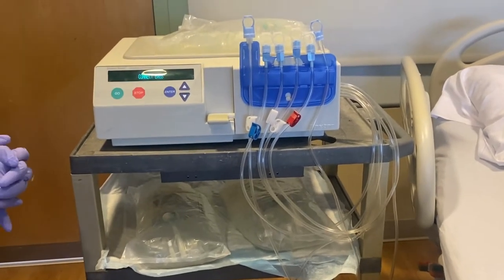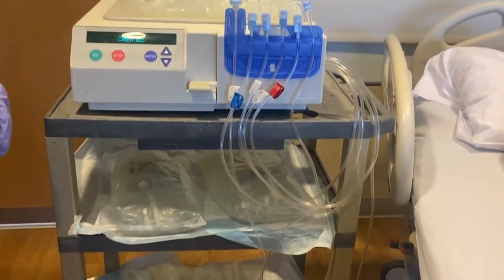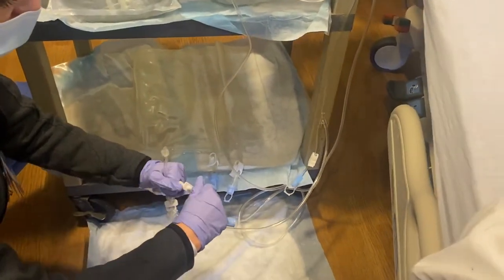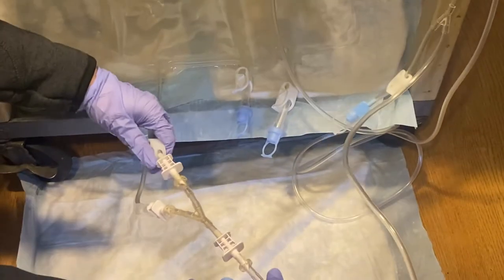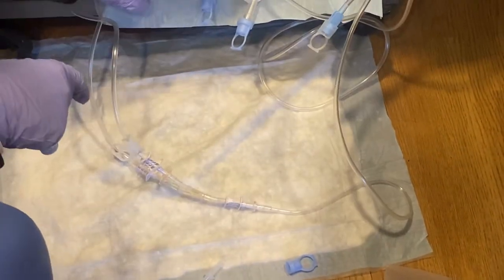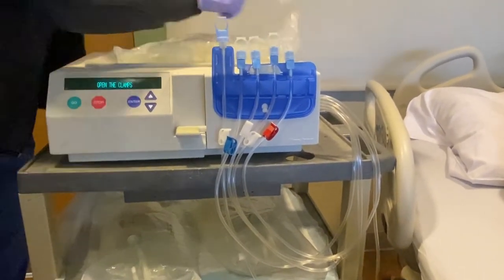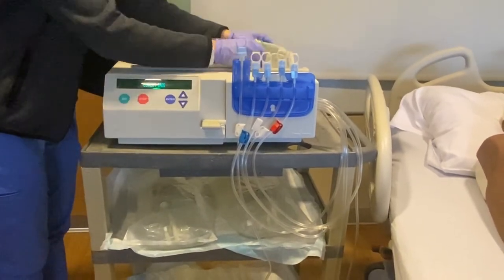Once the self-test is complete, the machine will tell us to open the clamps and connect the bags. We have all bags ready, so we begin connecting our lines. The line furthest to the right is the drain line. Using the pinky technique, connect the drain bag lines to the drain line. Open up the two bottom clamps — however, never open the two large white clamps. Moving up, the red line goes to our top bag — red is hot.